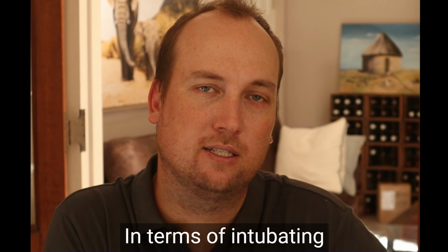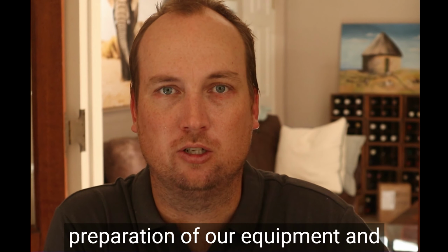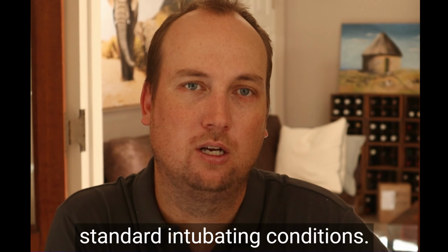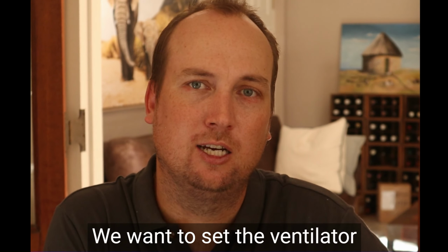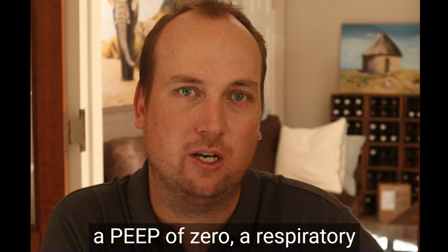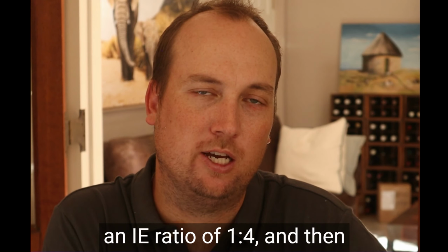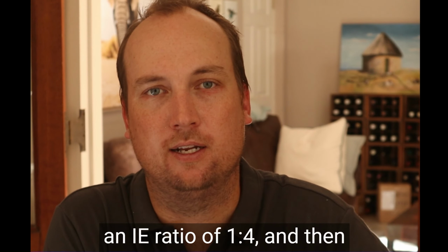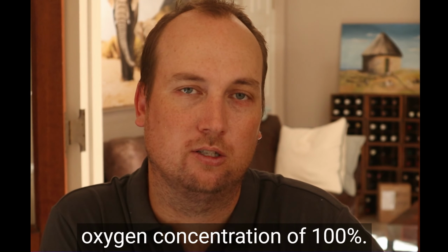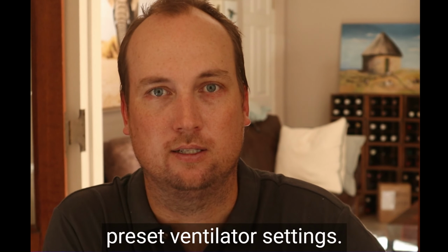In terms of intubating someone who's in acute severe bronchospasm, obviously all the preparation of our equipment and our drugs needs to be done as per standard intubating conditions. We want to set the ventilator before induction and intubation. And our ventilator settings are a PEEP of 0, a respiratory rate of 6 breaths per minute, an IE ratio of 1:4, and then a tidal volume starting at 200 mL with an inspired oxygen concentration of 100%. Those would be our preset ventilator settings.